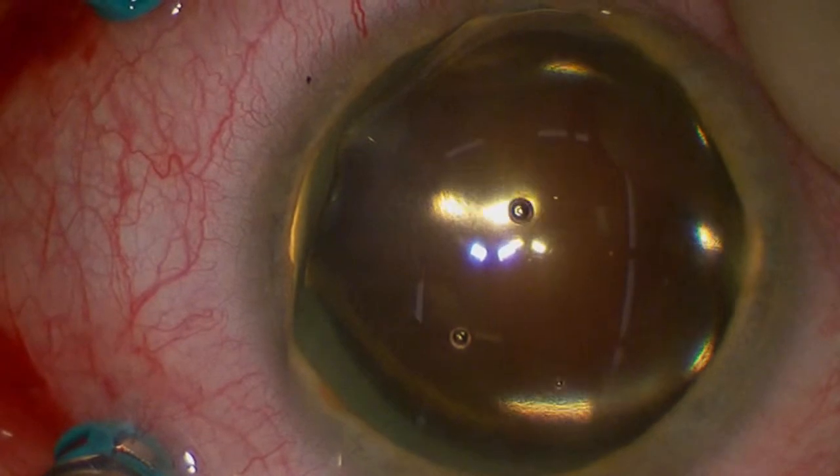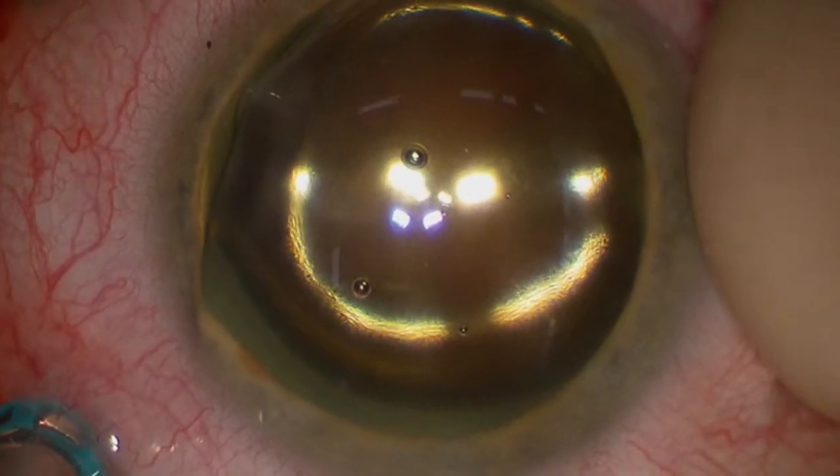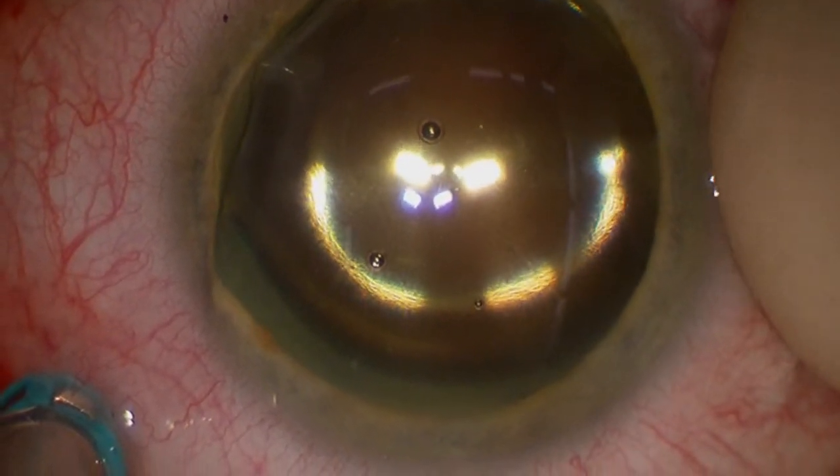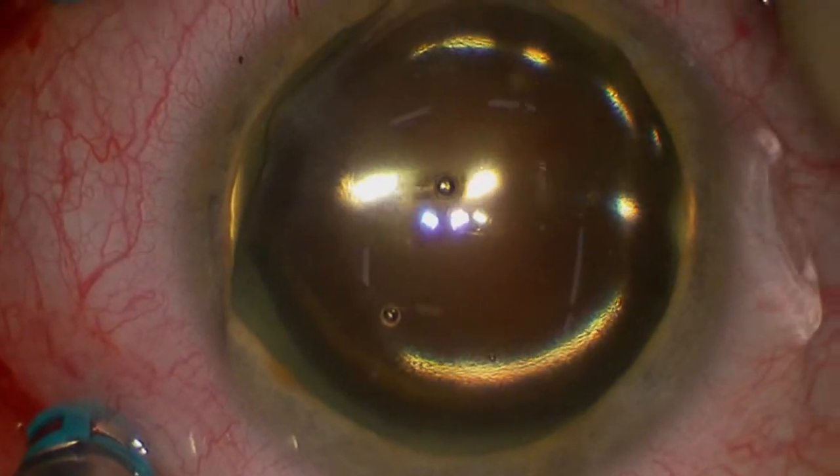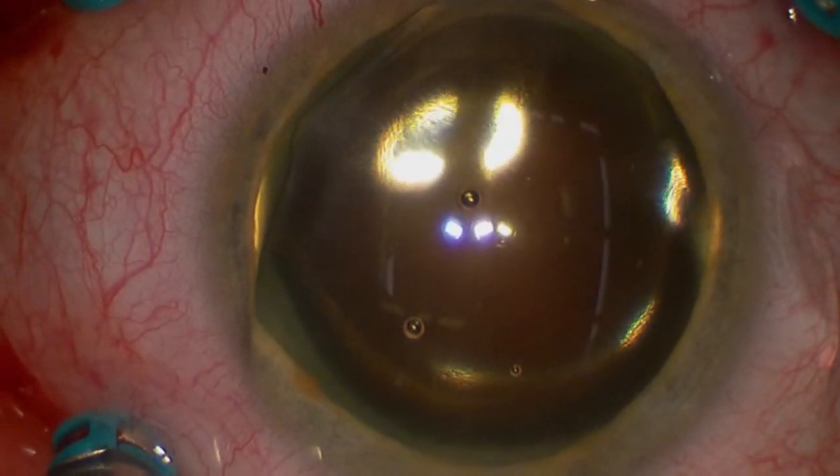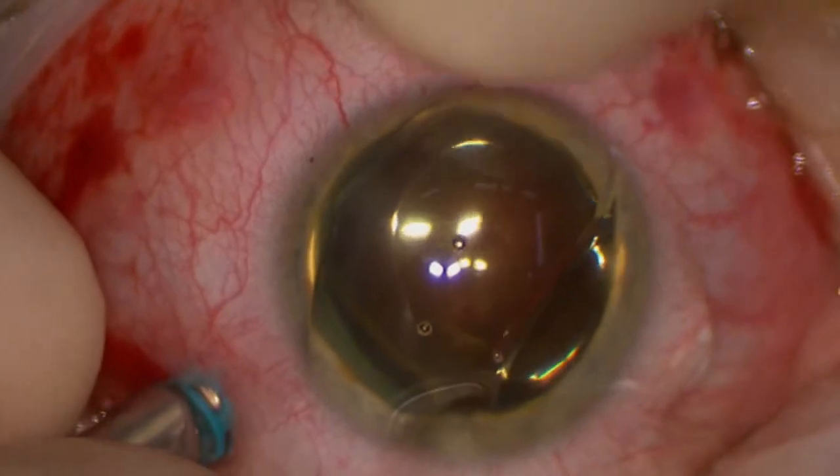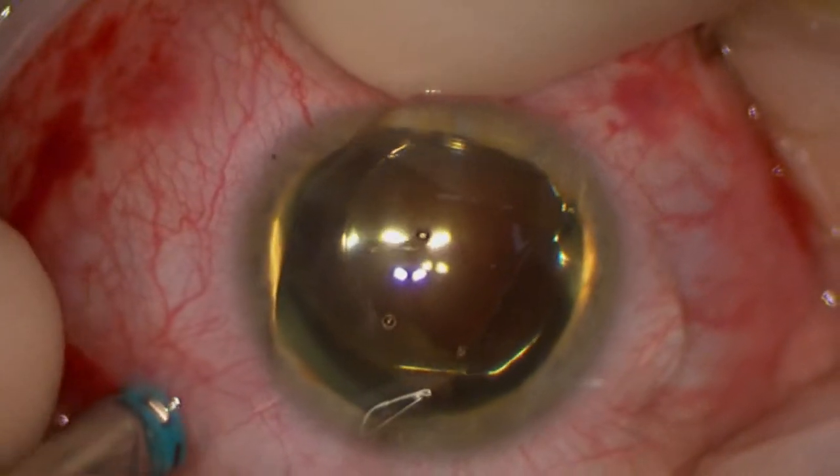Now here we're exchanging the air in the eye for a gas bubble. In this case, we'll use a gas called SF6 that stays in the eye about two weeks, and this keeps the retina dry and in position until such time as it can heal in place.